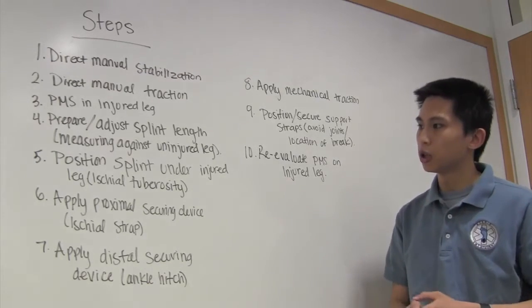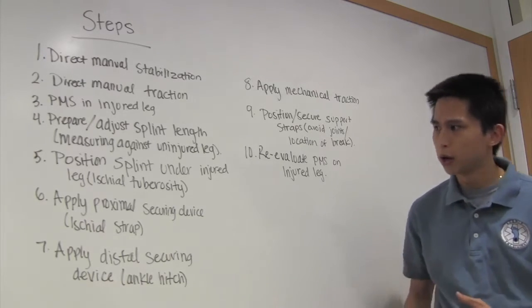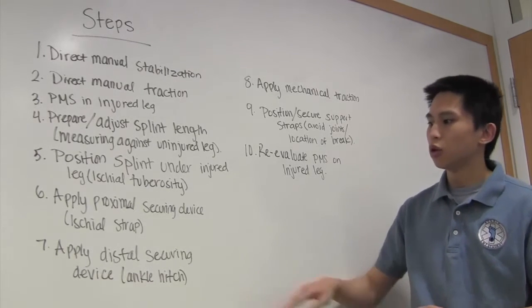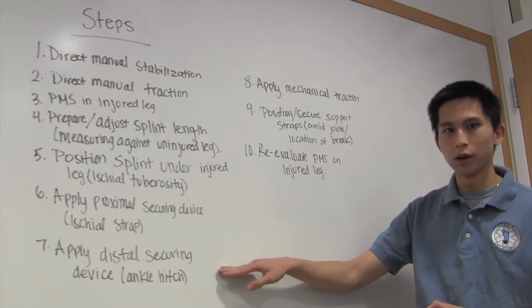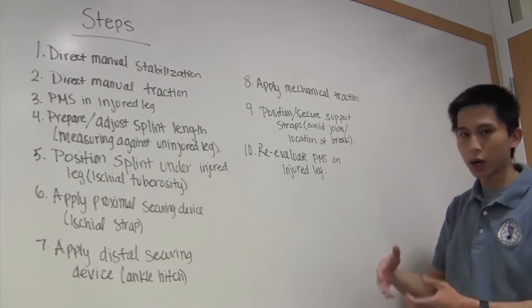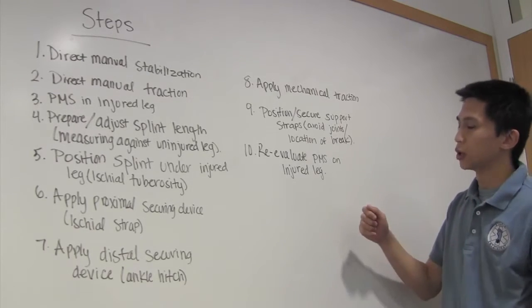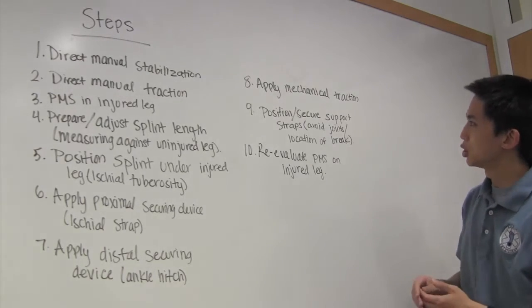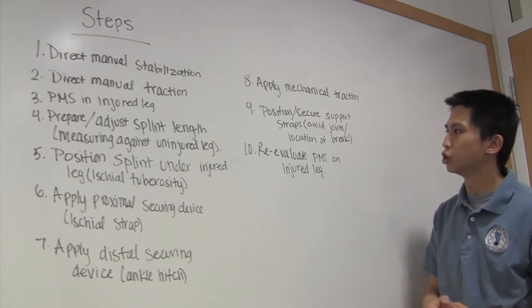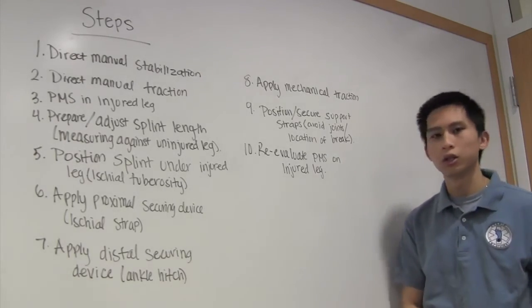You'll prepare and adjust the splint length according to the length of the uninjured leg. Then position the splint under the injured leg, under the ischial tuberosity, or under the butt. Apply the proximal securing device, or the ischial strap, then apply the distal securing device, otherwise known as the ankle hitch. You'll apply mechanical traction using the splint to replace manual traction, position and secure the support straps avoiding joints, and then reevaluate PMS on the injured leg.